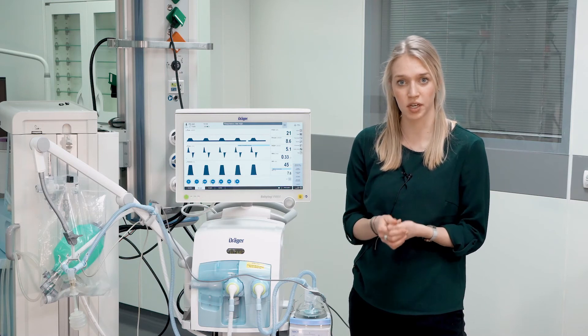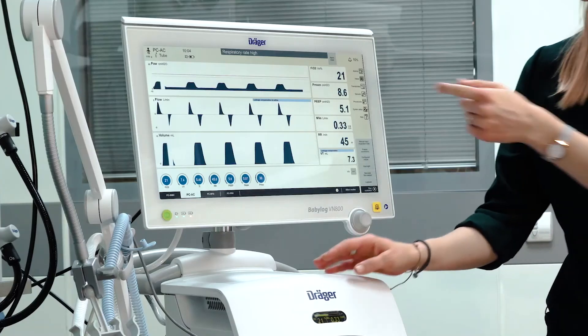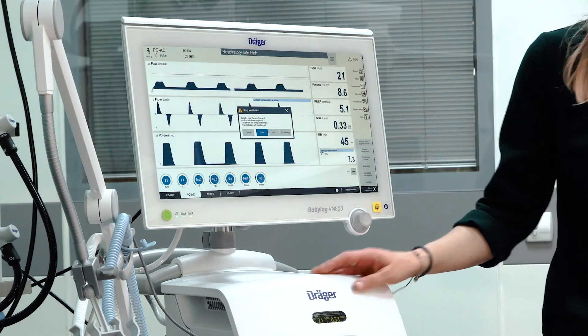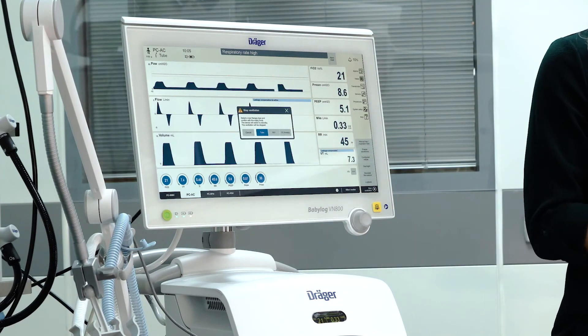If you want to change to a different therapy type like non-invasive ventilation or O2 therapy, simply press on the symbol tube. You will be informed that the ventilator will switch to standby. You can then change the equipment.